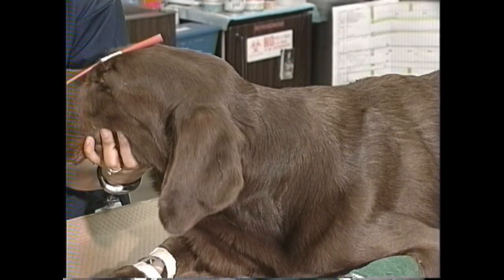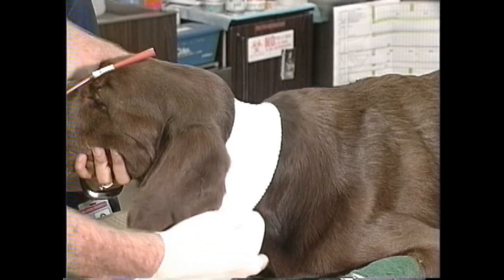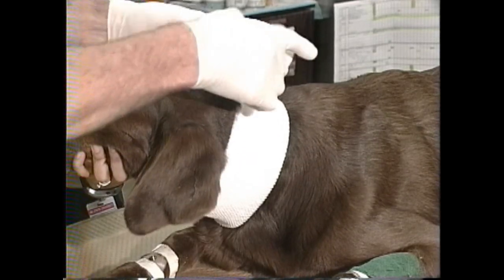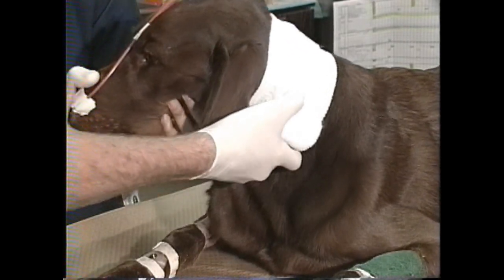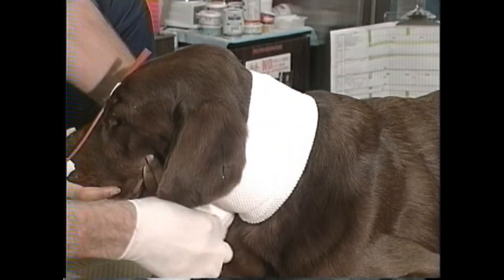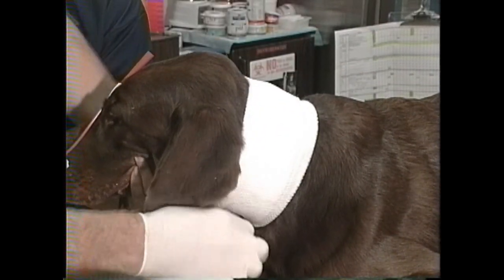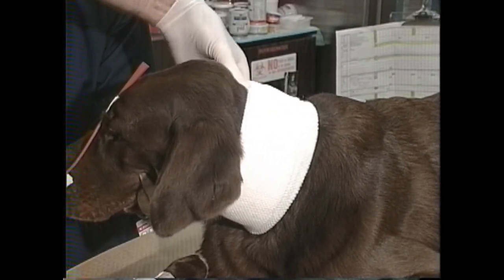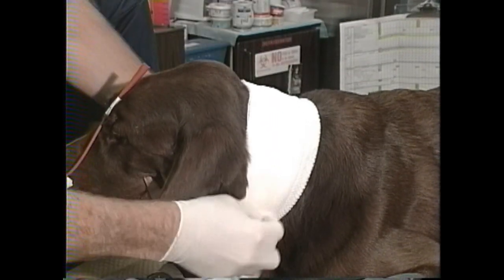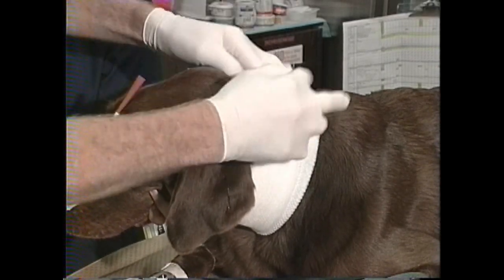Next we have to anchor the catheter to some bandaging material around the dog's neck. You never want the suture over the frontal sinus to be responsible for holding the oxygen supply line to the catheter. So if the dog does not already have a collar or a central venous catheter in a jugular vein, we'll make a soft padded collar out of cast padding, elastic gauze, and vet wrap, and tape the tubing to that to relieve any tension from the suture on the frontal sinus.